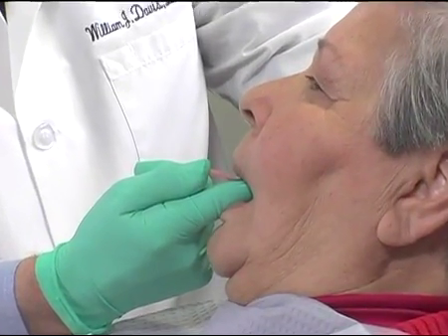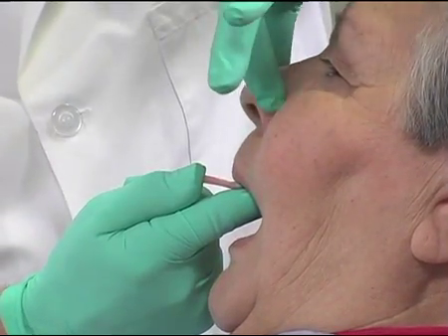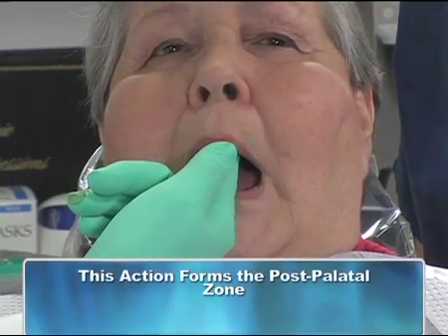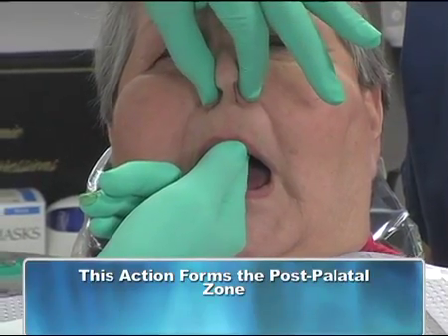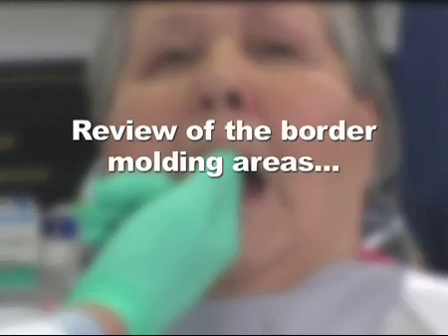5. Occluding the nostrils and then coughing will facilitate the soft palate to migrate to its natural anterior functional position, thereby forming an ideal post-palatal zone. Let's review optimal maxillary border molding areas.